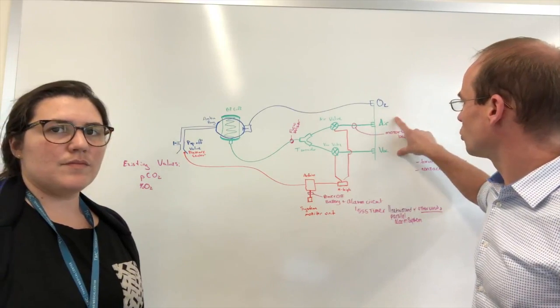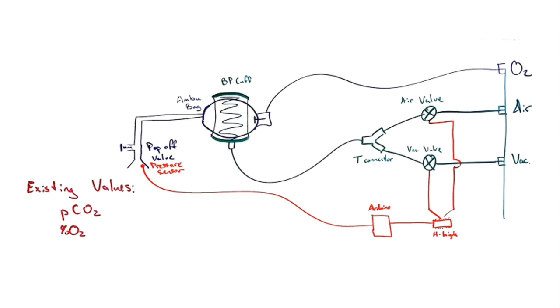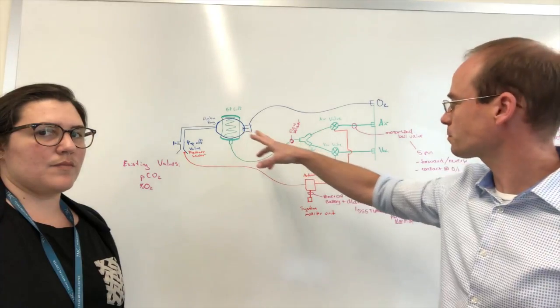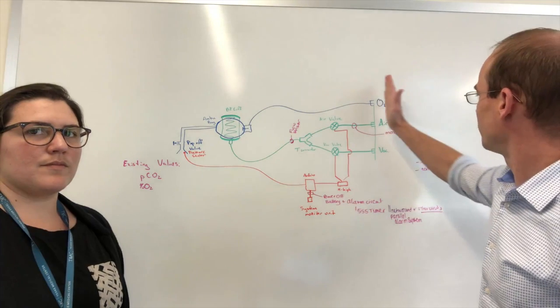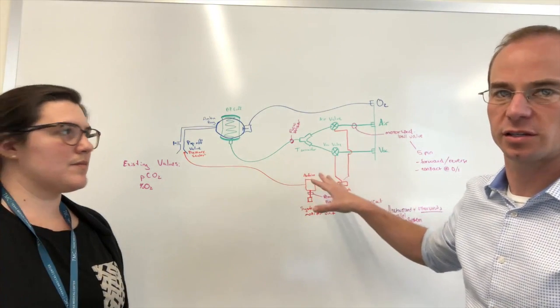What we have is green, the air supply to the pressure bladder. Right now we're using a blood pressure cuff. But the green air will not go into the patient. The blue is the air supply to the patient. And right here is the wall. And then the red is the electrical components in the system.